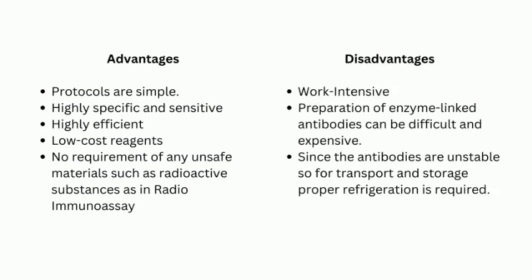The advantages are that the protocols are simple, highly specific and sensitive, economical and safe for the user without any health hazard, unlike in radioimmunoassay. And the limitations are it is work intensive as many steps are involved. Preparation of enzyme-linked antibodies or antigens can be difficult and sometimes expensive also. Since the antibodies are unstable, for transport and storage, proper refrigeration is required.